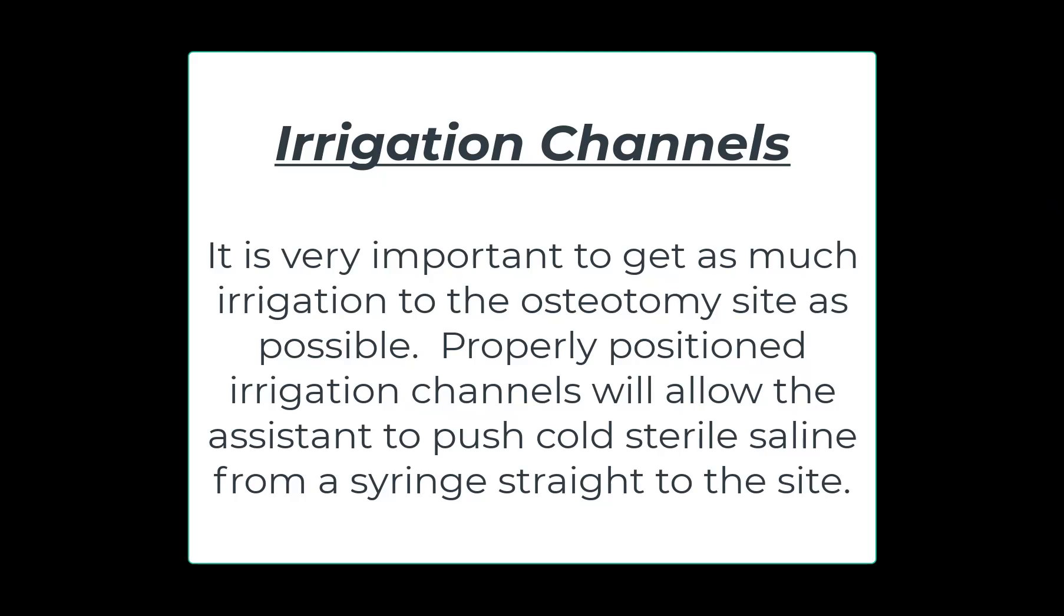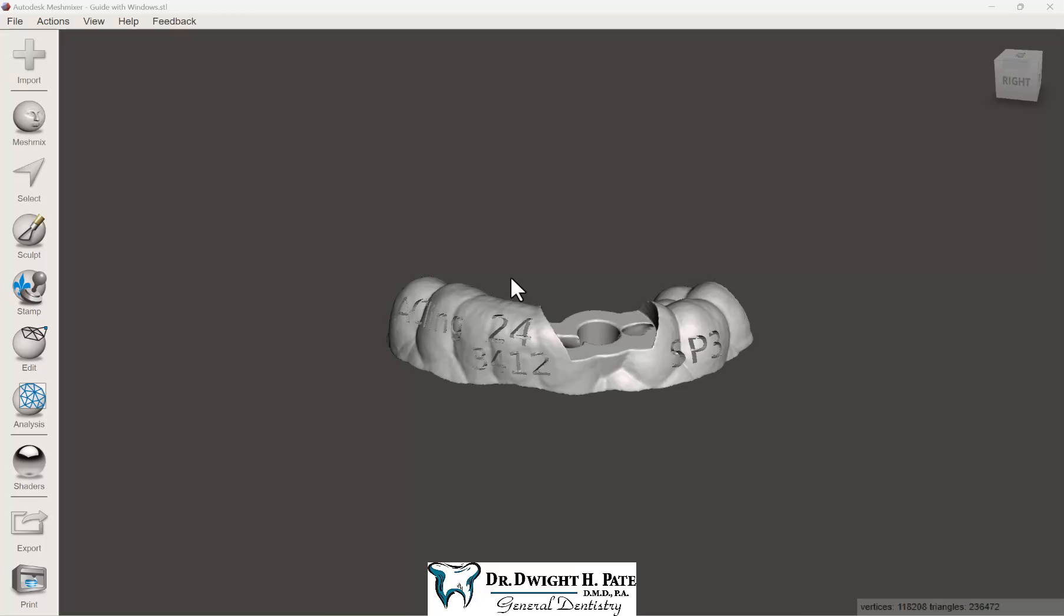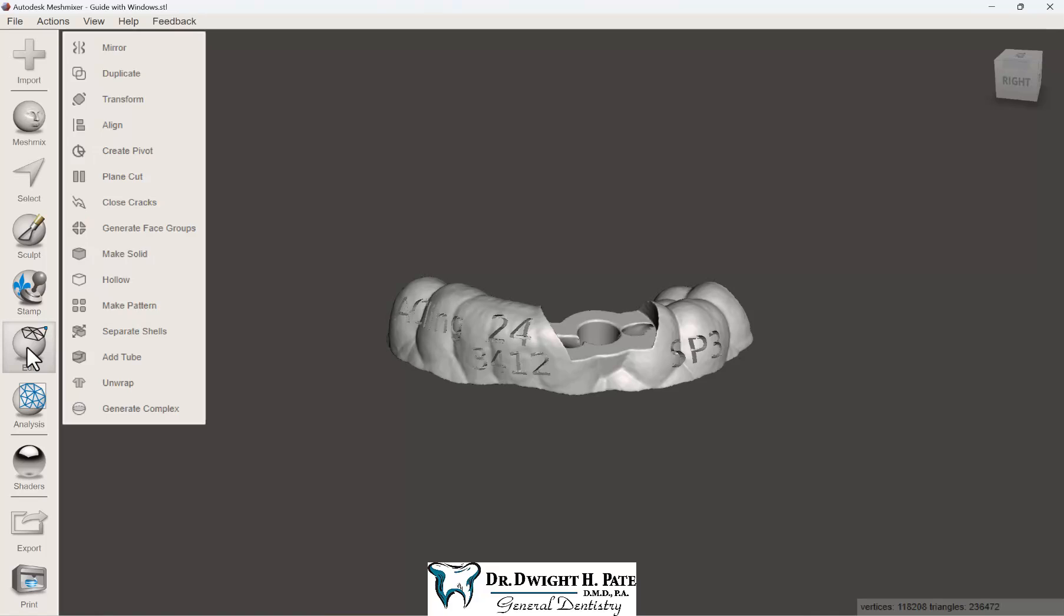This is a quick video showing how to add irrigation channels to a surgical guide in Meshmixer. You can cut these with a burr after the guide is printed, but I like to do it digitally so I don't risk breaking the surgical guide after it's been printed.